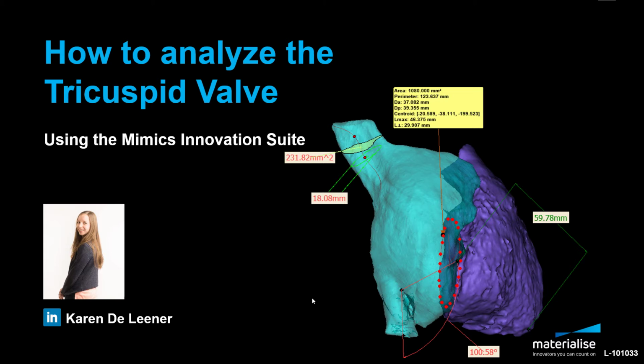The standard treatment is open heart surgery, which comes along with multiple risks. As an alternative, transcatheter-based solutions are rapidly gaining interest. With this technique, a replacement or repair device is inserted via the inferior or superior vena cava and positioned at the tricuspid valve. Currently, there is a variety of these transcatheter replacement and repair devices being developed.